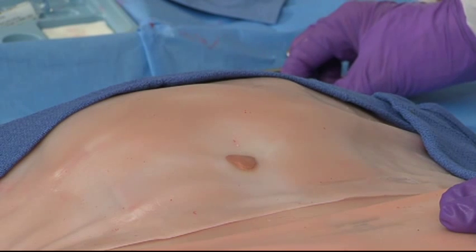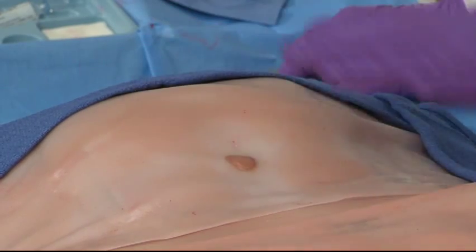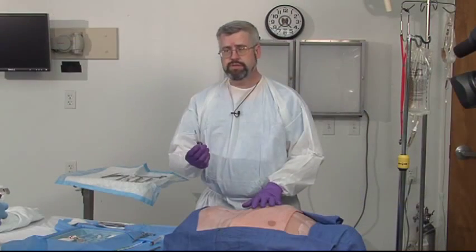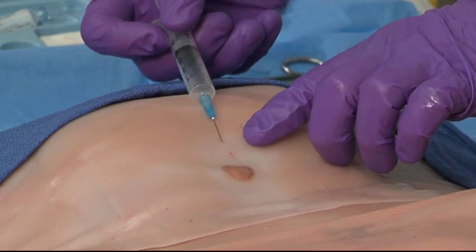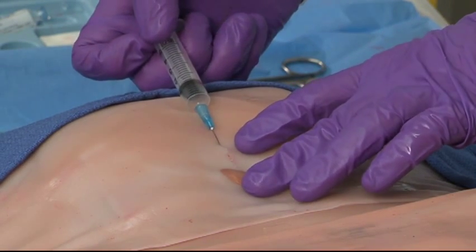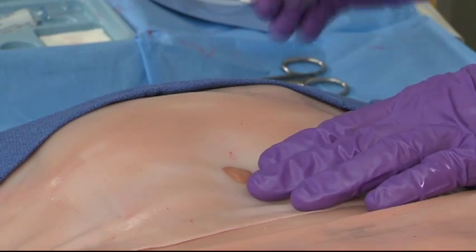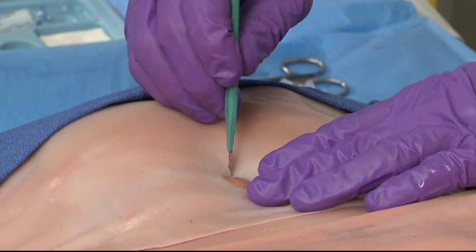The open DPL is technically a surgical procedure and needs to be done sterilely. Make sure you've thoroughly prepped the abdominal wall and use local anesthesia if you can. We're going to go below the umbilicus unless the patient is suspected of having a pelvic fracture or is pregnant. We're going to raise a wheal using lidocaine with epi — it's very important to use lidocaine with epi because you want to minimize bleeding from the skin so that you don't get a false positive tap. We're then going to make an incision about one and a half to two centimeters vertically below the umbilicus.